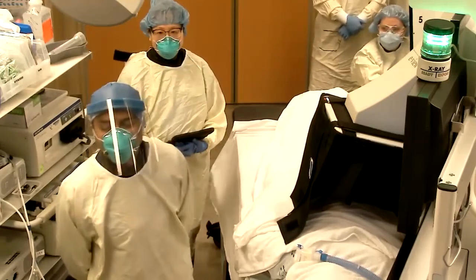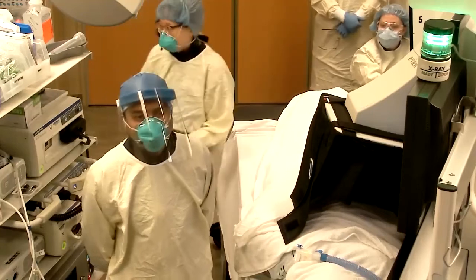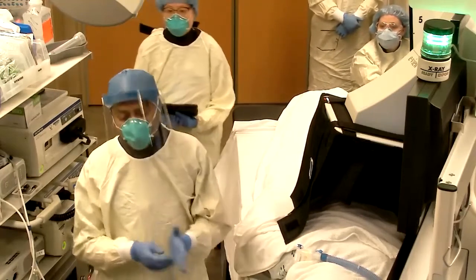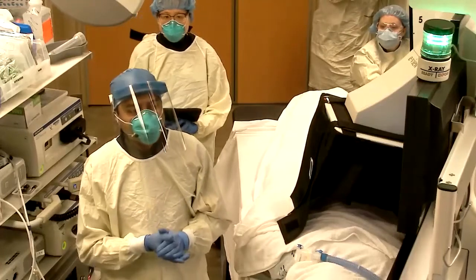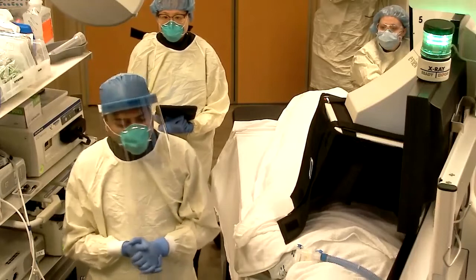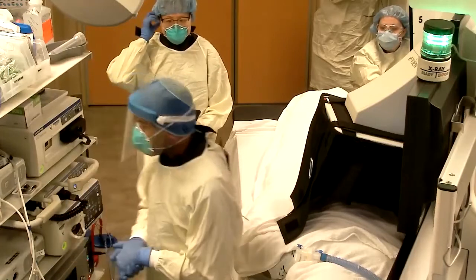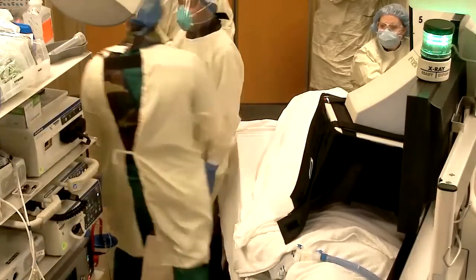So we thought we will utilize the single-use duodenoscope for this procedure because we are trying to minimize our technicians from handling infective endoscopes that has bodily secretions. And this is one opportunity to minimize infection risk, although this is not a COVID patient. So we will now have the single-use duodenoscope be removed from the package.